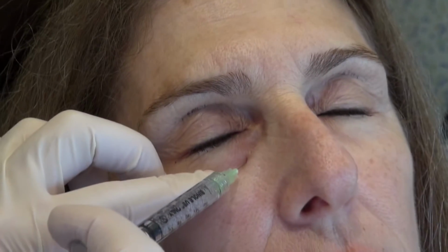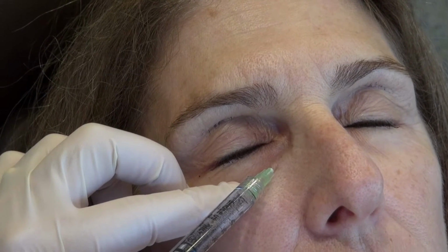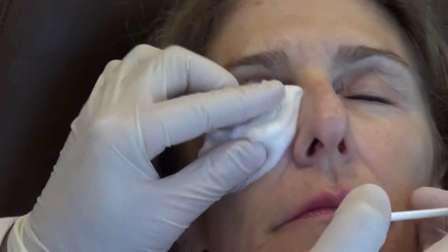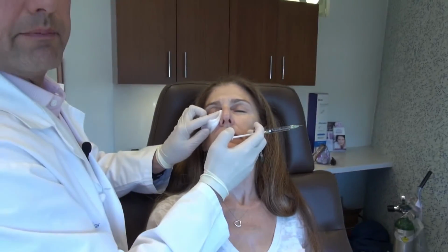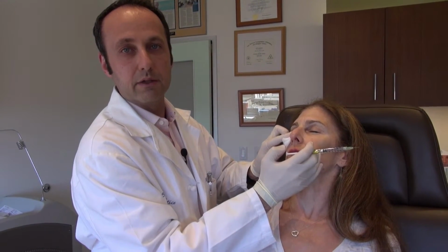The other precaution that I take in terms of safety is that I never push hard on the plunger, so that I'm never putting filler in under pressure. When we see really bad adverse events, such as blindness, necrosis, and stuff like that, we see that in the context of filler going in under extreme pressure.